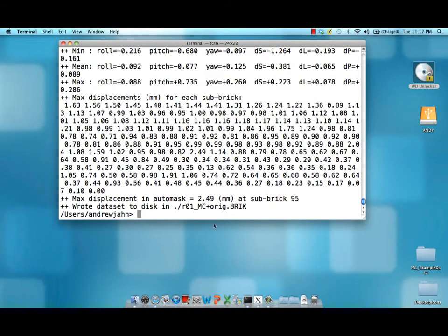And so it's done, and it's output this motion corrected data set into r01 underscore mc.